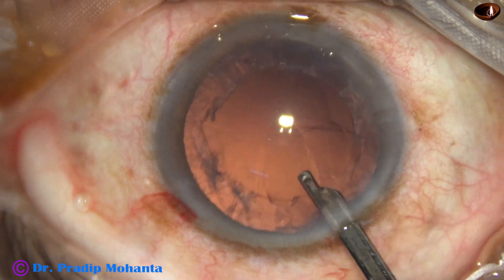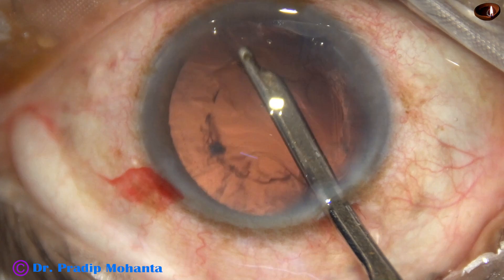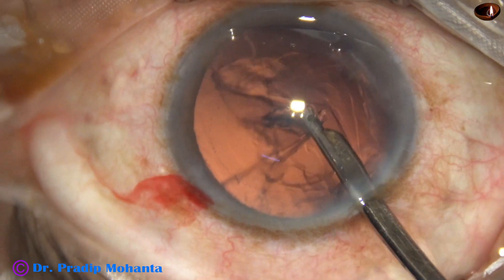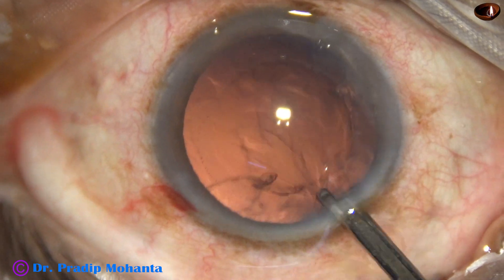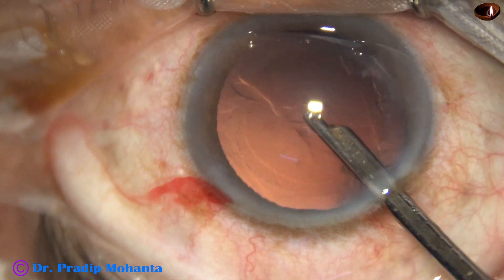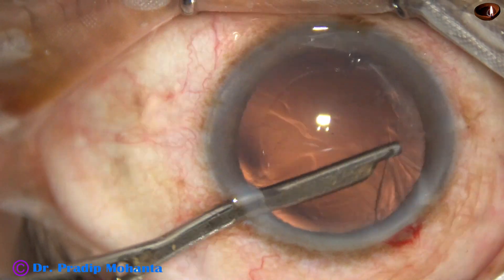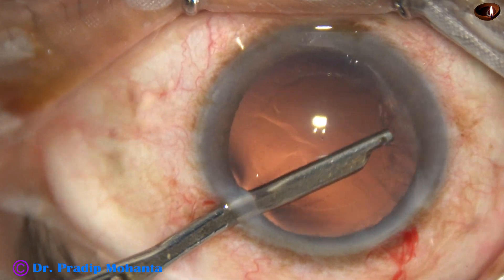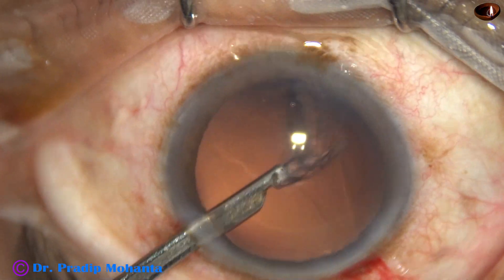This is just to maintain the anterior chamber when I am removing the cortex. If there is viscoelastic, the collapse of the anterior chamber is not sudden, and as long as the visco remains, the anterior chamber is better maintained. Now I go through the side port and remove the cortex from the sub-incisional area.